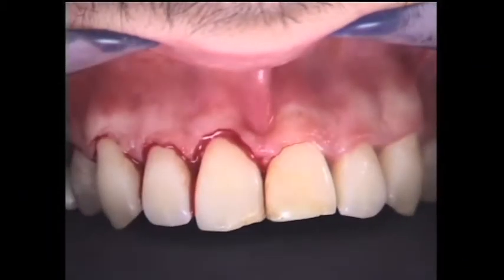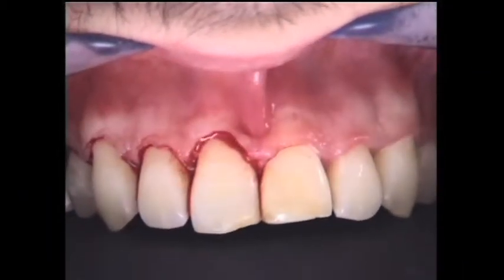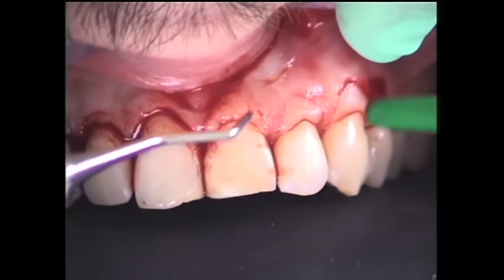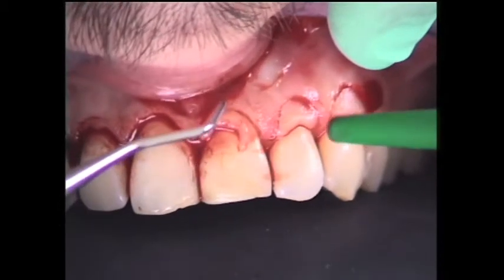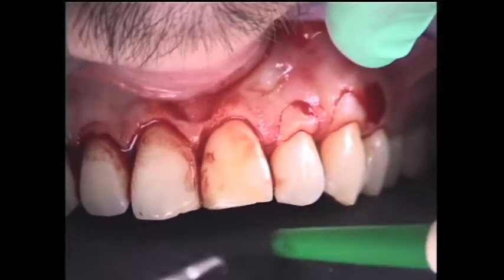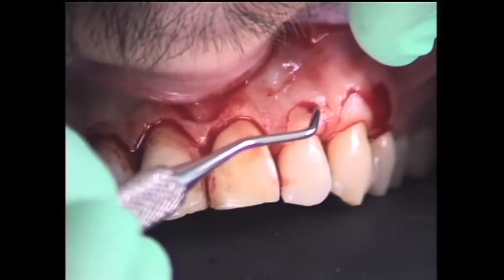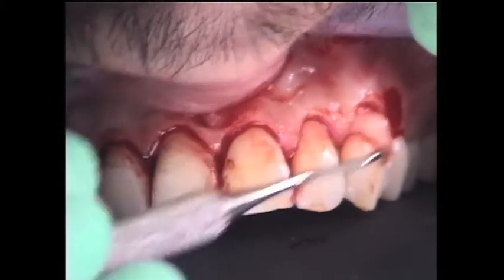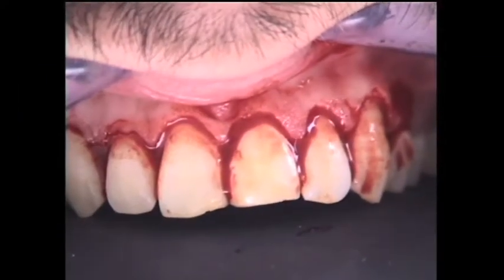Once the incisions are completed, we remove the collar of soft tissue with a curette and we expose the original anatomy of the teeth. We can see with the use of a curette how to remove the collar of tissue that is covering the enamel of the teeth. We can see the beautiful natural anatomy being exposed, and the patient already has a new smile before flap elevation.